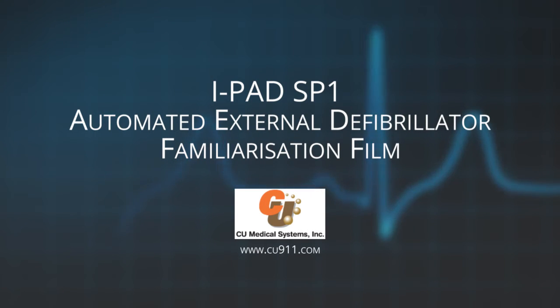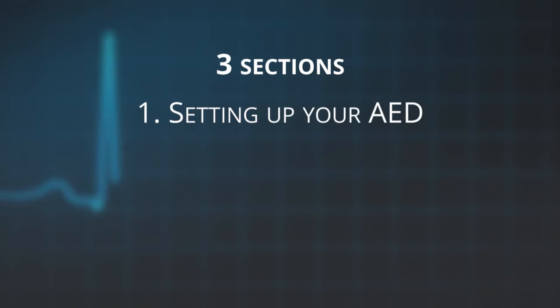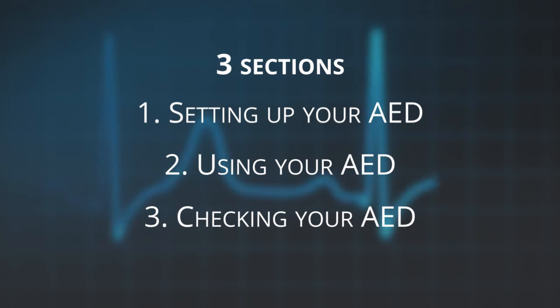Welcome to the familiarization of your iPad SP1 automated external defibrillator. This film will go through three sections: one, how to set up your AED; two, how to use your AED; three, how to regularly check your AED.